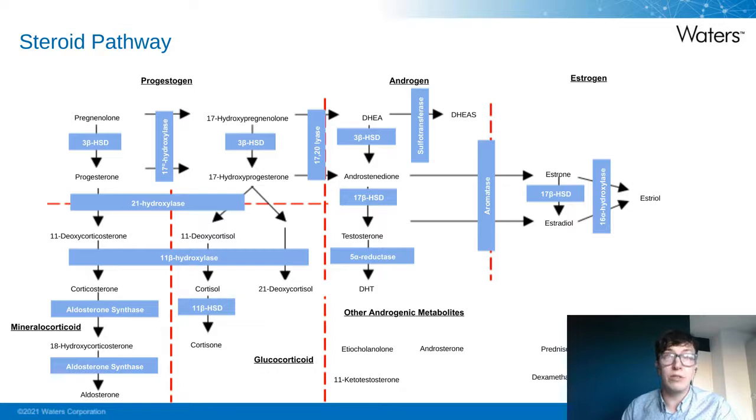Before I provide an introduction to the calibrator and QC sets, I thought it would be useful to provide a bit of background into the steroid metabolism and challenges associated with steroid hormone testing. So this slide here demonstrates the key steroid hormones and associated enzymes that play a role in steroid metabolism.